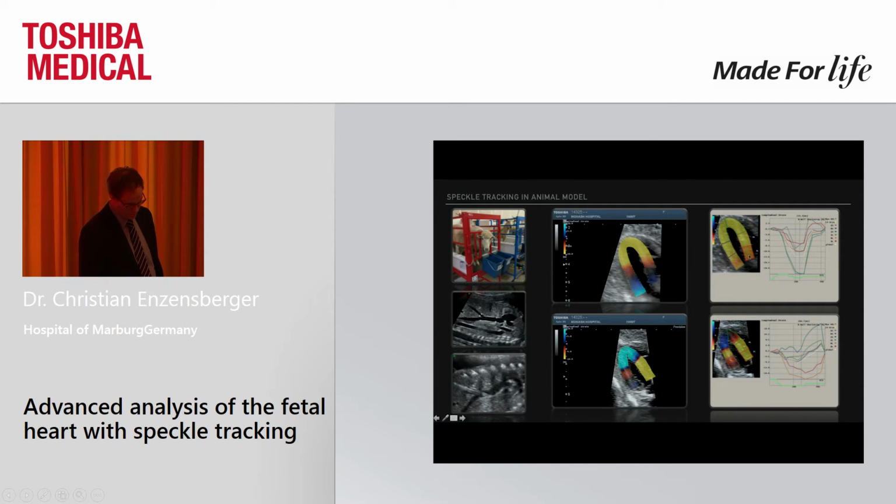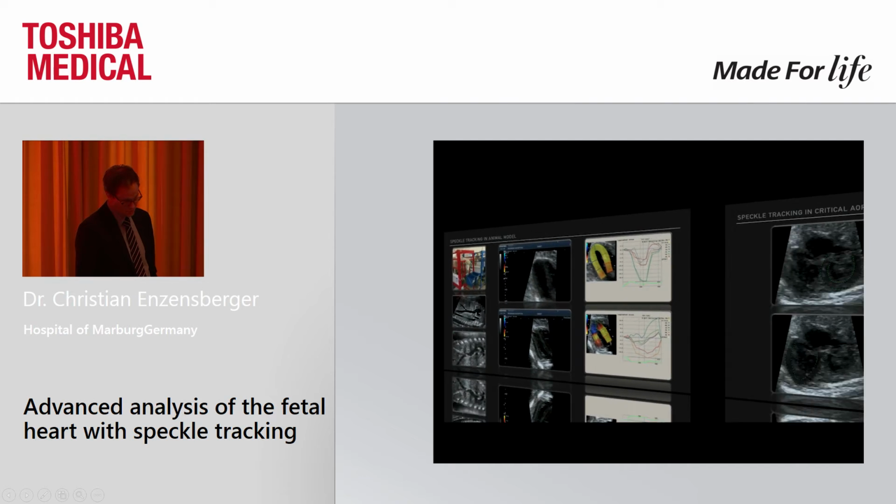This is before the intervention, very high longitudinal strain values in the apical segments, and directly afterwards, after placing the occluder, you could see that there was more or less nothing left of the apical movement, totally disturbed myocardial motion in this case.